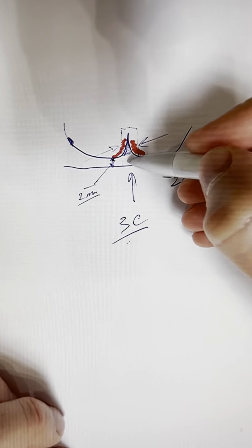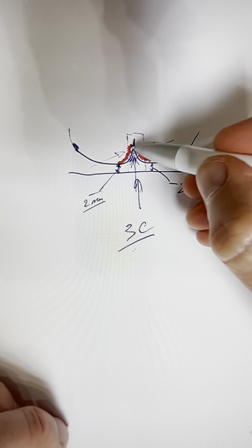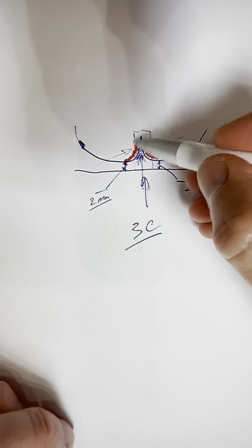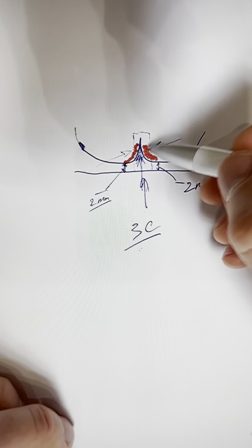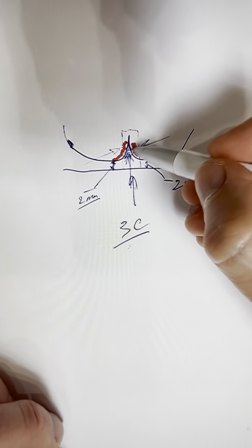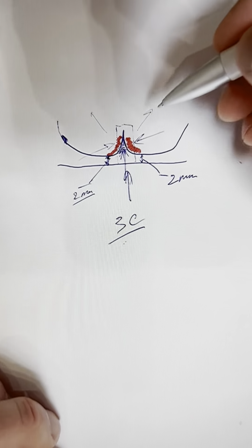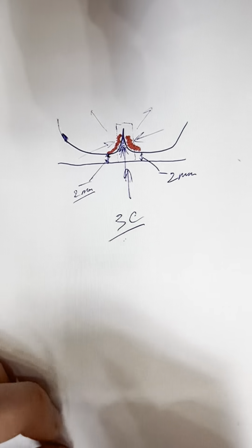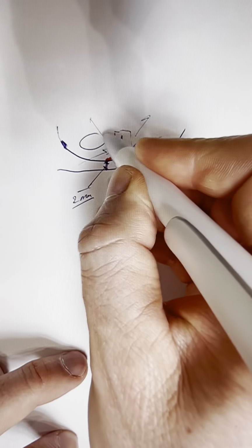As a result, it will seem to you that you are in a bone tissue on one side because you will constantly rest against the bone tissue on the septa, and on the other side, the drill will perforate the Schneiderian membrane while drilling. So you will get an unfavorable perforation here and here, and an implant may shift either medially or distally. Therefore, in this case, it's necessary to perform a lateral sinus lift.